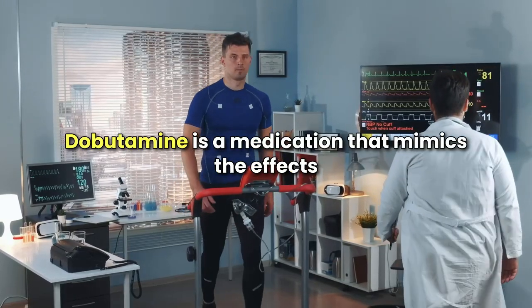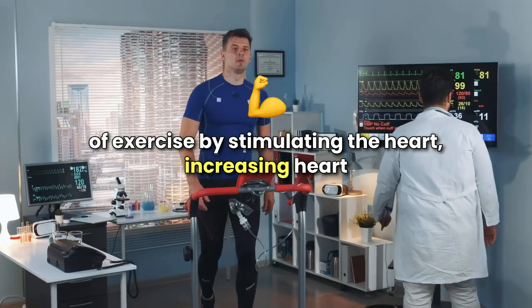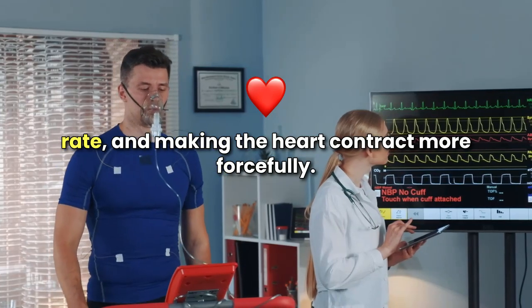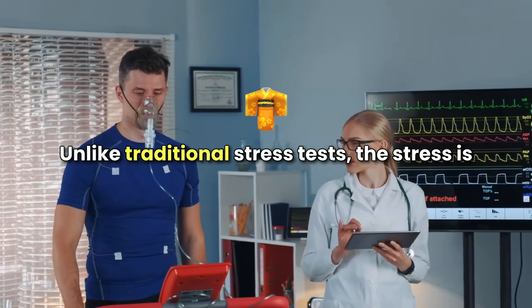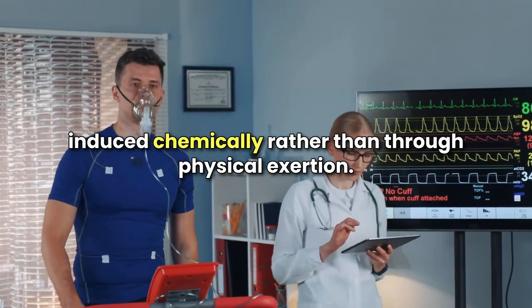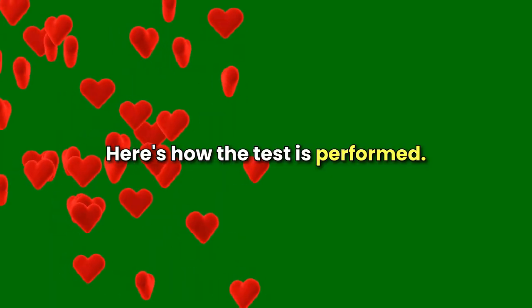Dobutamine is a medication that mimics the effects of exercise by stimulating the heart, increasing heart rate, and making the heart contract more forcefully. Unlike traditional stress tests, the stress is induced chemically rather than through physical exertion. Here's how the test is performed.